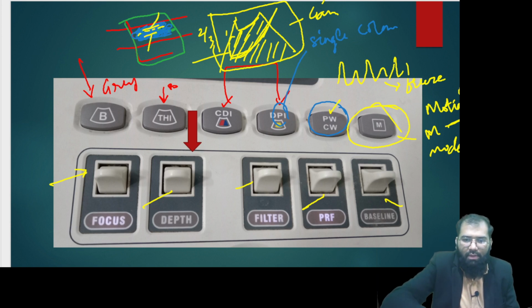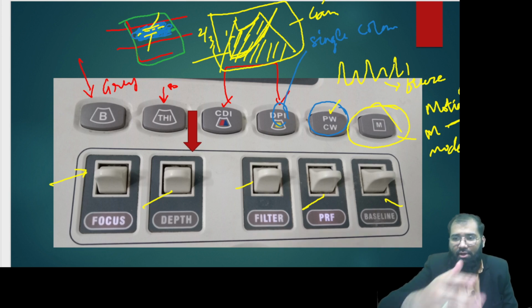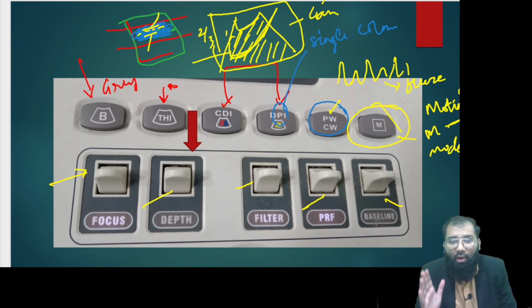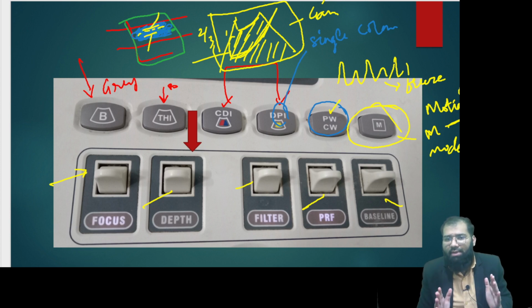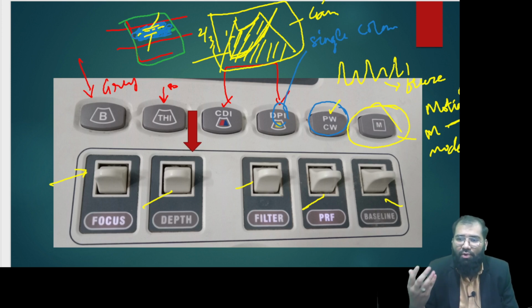Here I would end this session, and in the next session we'll continue and I'll discuss further the various knobs and the physics part. More important than discussing knobs and physics, what I'm trying to tell you is how everything will be useful to you, how this would be useful in your practice. Okay, fine, we stop here.